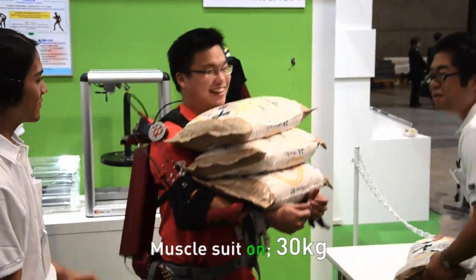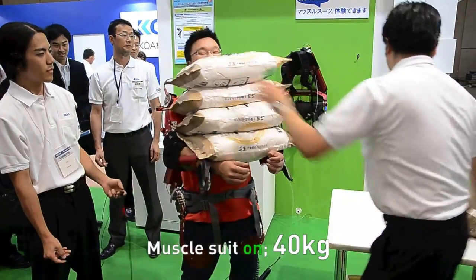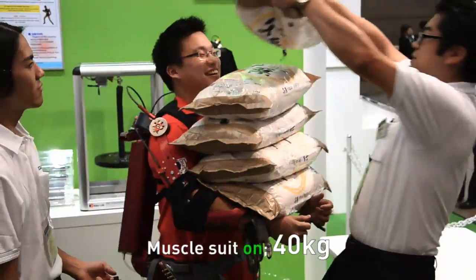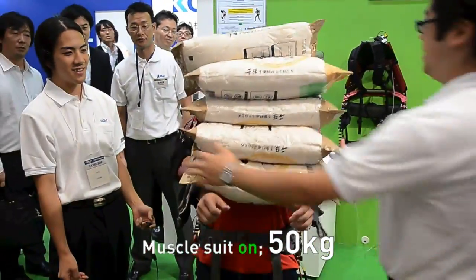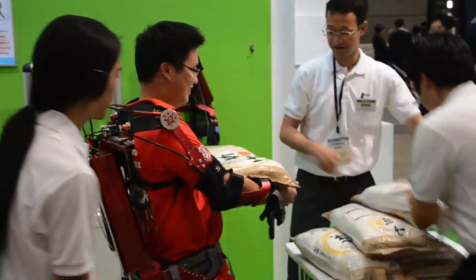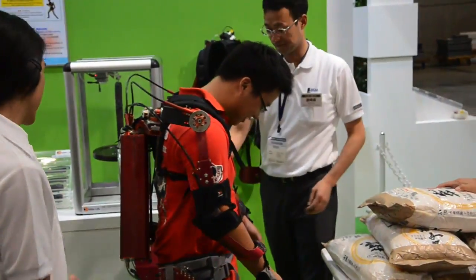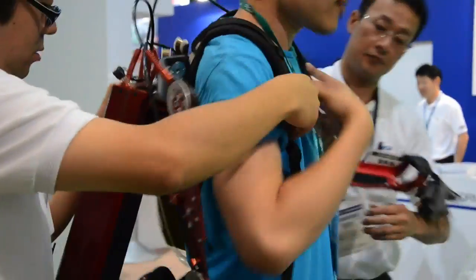We're going to put another 10 kilograms. All right — 40. Then 50 kilograms. There you go. Whoa — this is awesome!